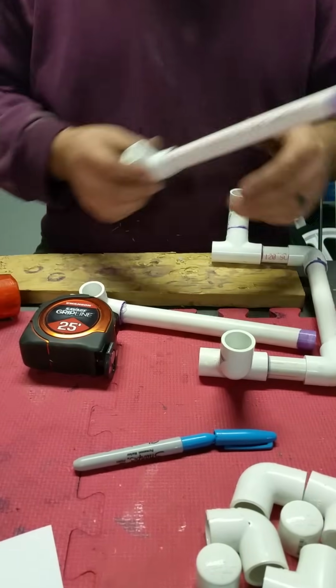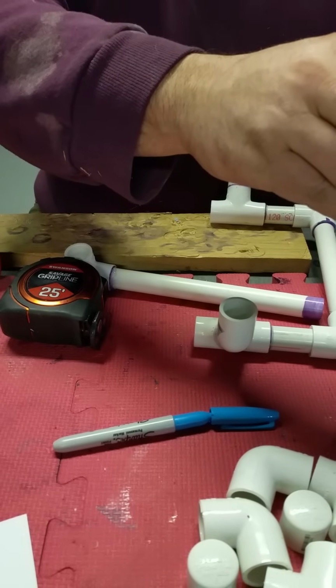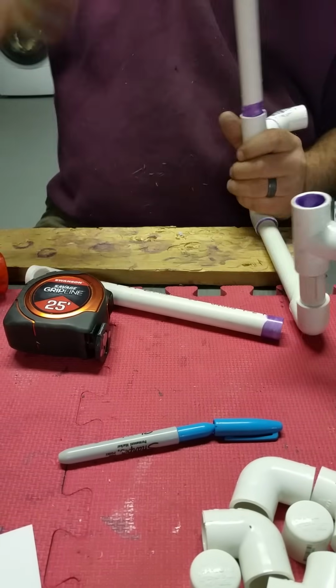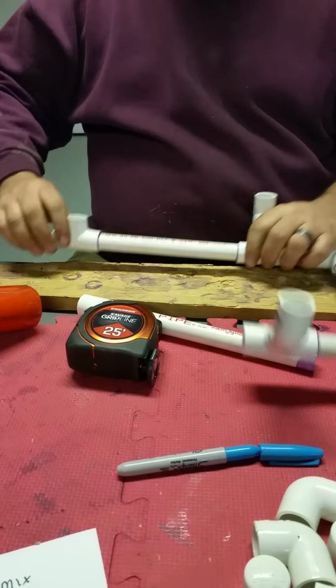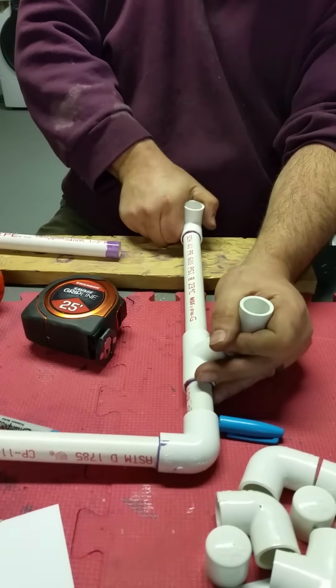And now when we put these pieces in, we're going to have to make sure that the T's are perpendicular to the table, so that they'll be straight and go down the dog's side and not under at an angle.